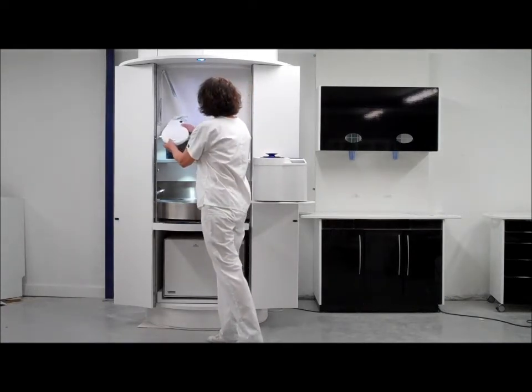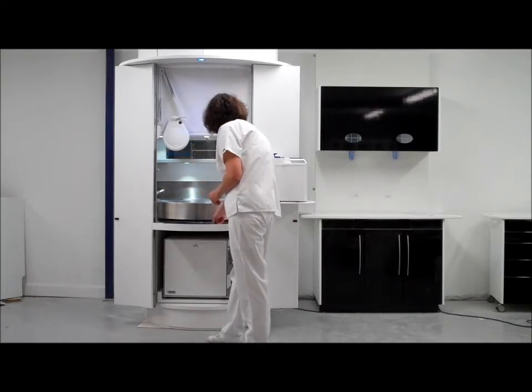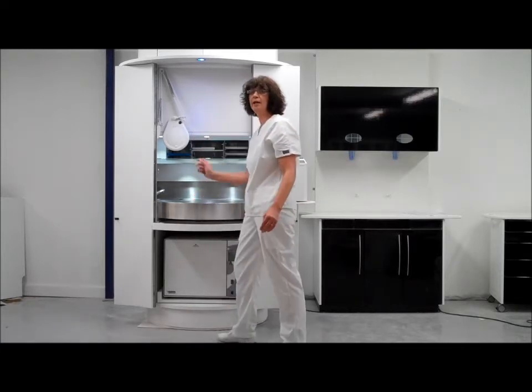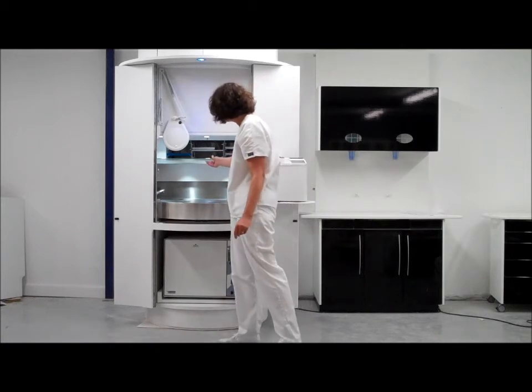Once the instruments have been cleaned and inspected, there is a pull-down section here and a pass-through which houses an ultra-violet light to stop any bacteria build-up, whilst we close the pod.